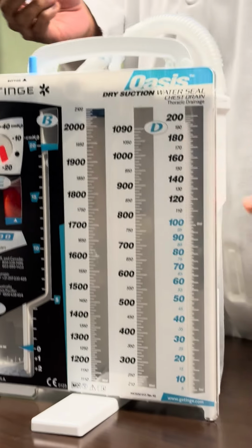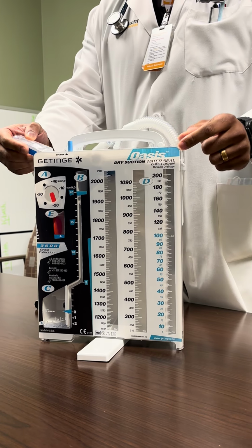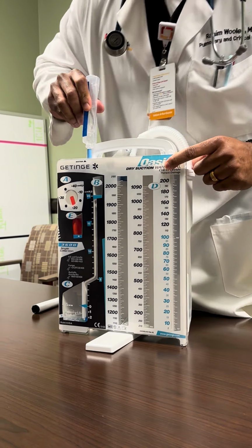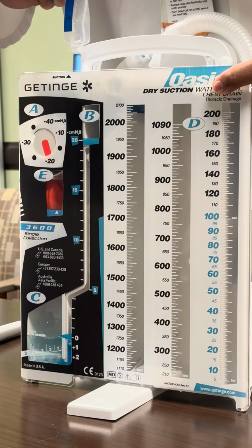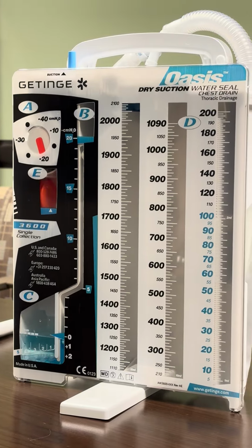So you have your water that you put in, and where do you put this again? You put this through the tubing, in the little blue container. And so you squirt it in, and then you have this water that goes in and it turns blue. It has blue coloring here, just so everybody can see it nice and neat, right?